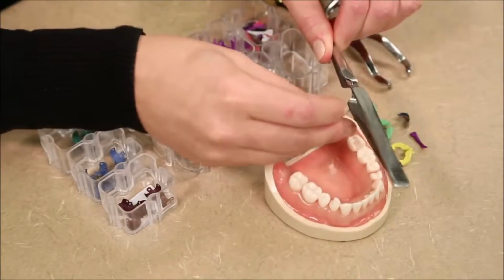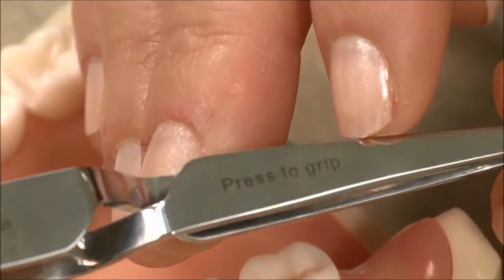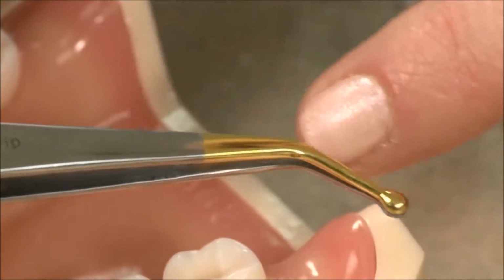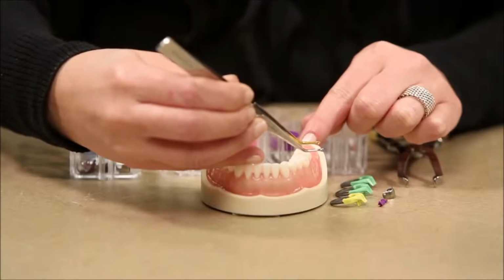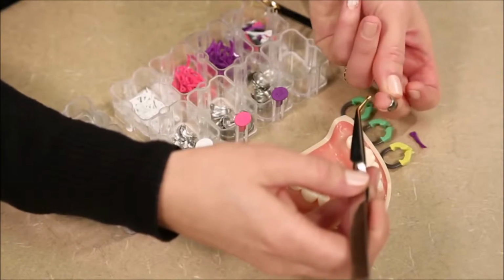We have a pin tweezer, which up here says press to open, and down at the bottom says press to grip. There's a gold side which would identify where the pin is located, and you can see that there's a little gold pin that sticks out. So in all of our consumables, you'll find a little hole, and that's going to fit in our pin tweezer.